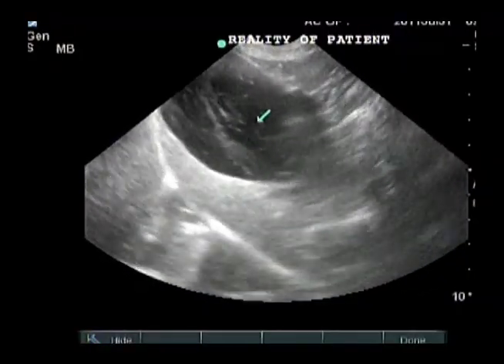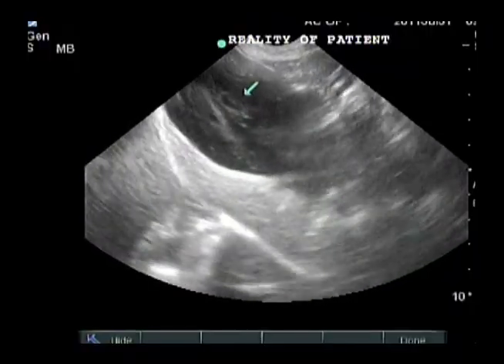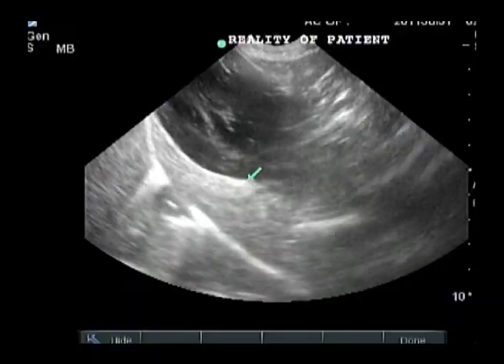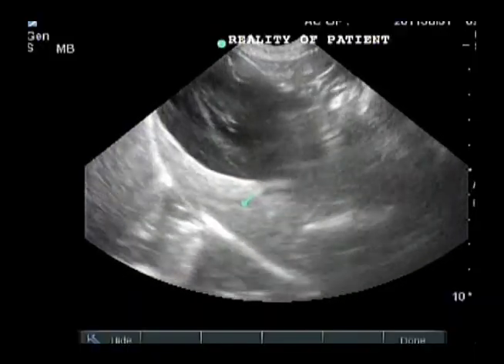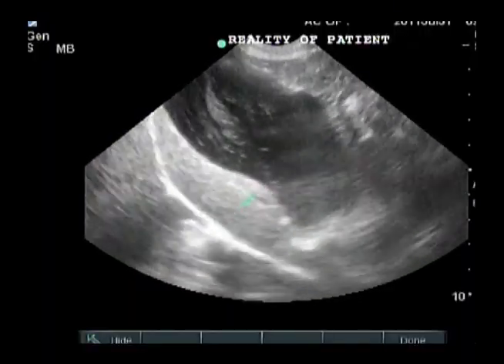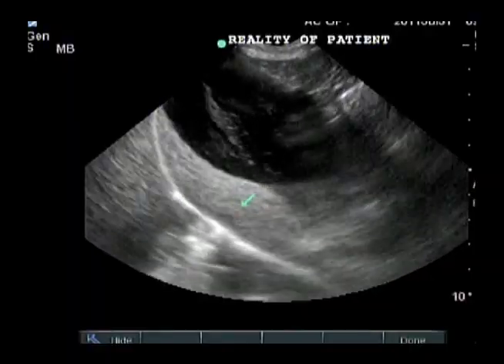A number of artifacts may occur in the gallbladder and the liver dorsal to it because the ultrasound waves passing through the gallbladder are not reflected or absorbed and not weakened. Use the TGC toggles to reduce gain in the area of the gallbladder and the dorsal liver to compensate for the artifact.